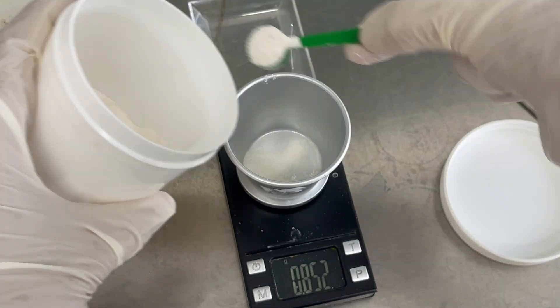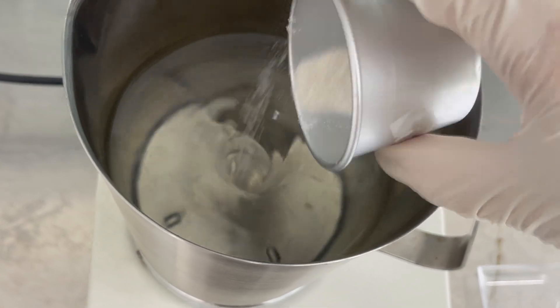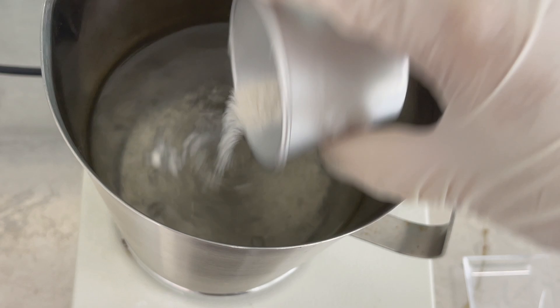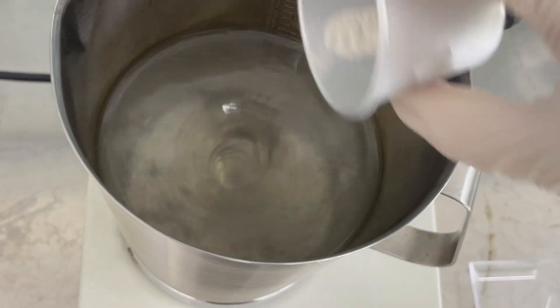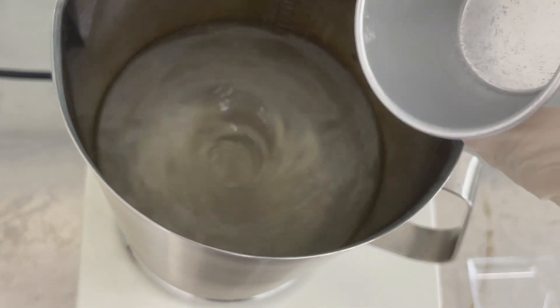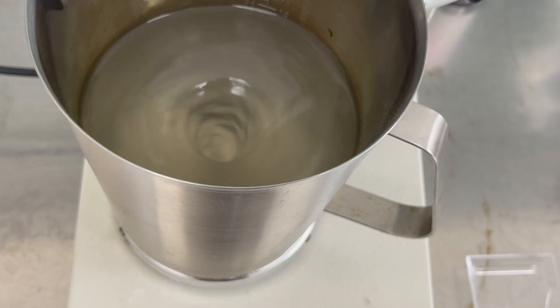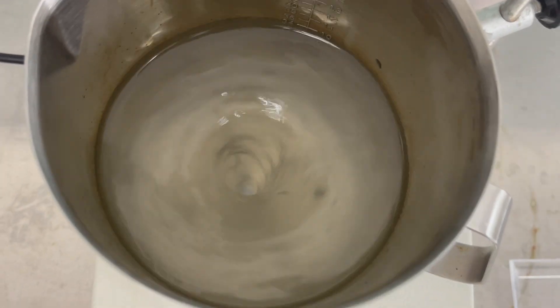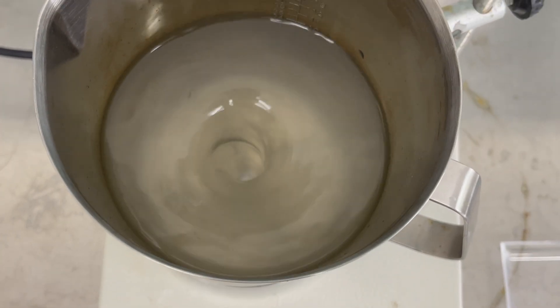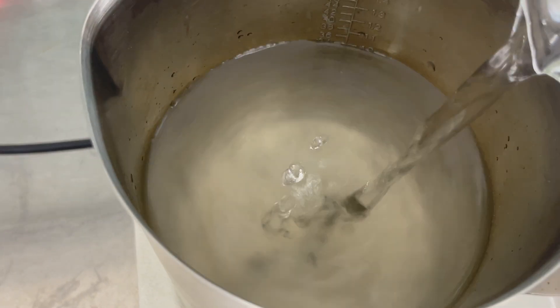Next, I weighed the agar and slowly added my gelling agent of choice. Different gelling agents require different amounts, so check the label or consult your supplier. Sprinkle it in gradually while stirring to avoid lumps, and be sure not to apply heat before adding the agar. Mix thoroughly until fully dissolved. As you can see, the solution has increased but hasn't reached 1 liter yet, so I'll be adding more water.